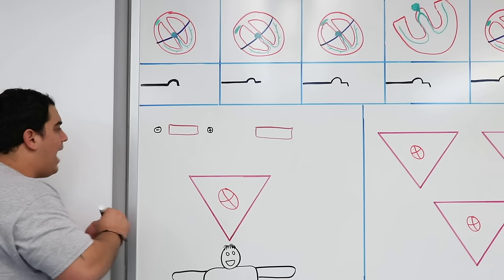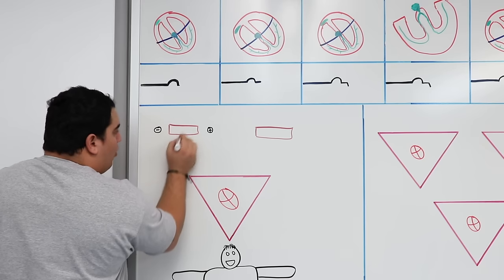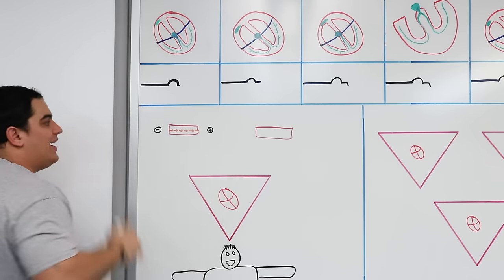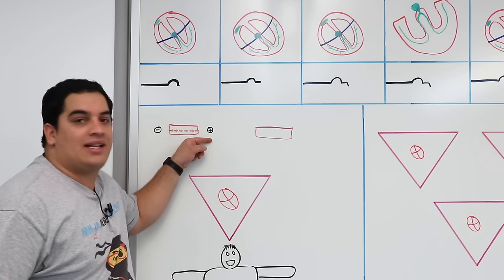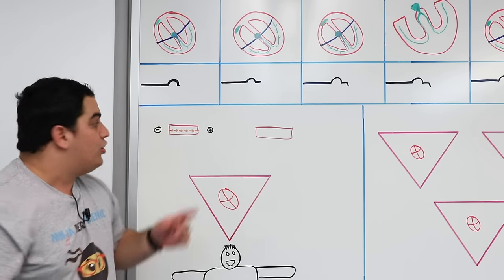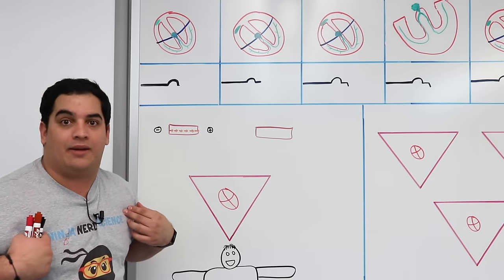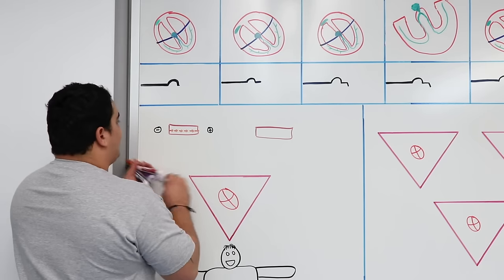Now, let's say that the cardiac tissue has the ability to generate its own electrical activity, and when it's generated, it moves in a direction towards the positive electrode. When the electrical activity of that tissue moves towards the positive electrode, it picks that up as a positive deflection. So when electrical activity, which is being conducted through a tissue, is moving towards the positive electrode, which are going to be these different things we put on the patient's body, it is going to have a positive deflection. So this will give you a positive deflection.